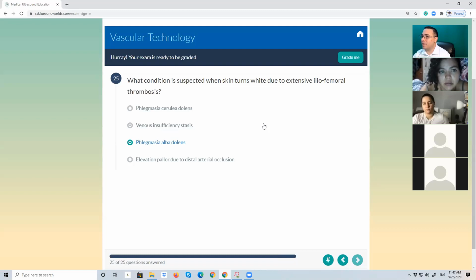There's a massive constriction of those vessels, so velocity is just going to go high. And that's also happening to the legs in this case? It happens in here as well, yeah. There is a vasospastic response, and that's why the patient has this white, pale coloration. Oh, right. Okay. All right, very good.